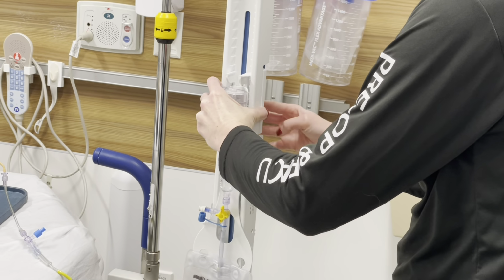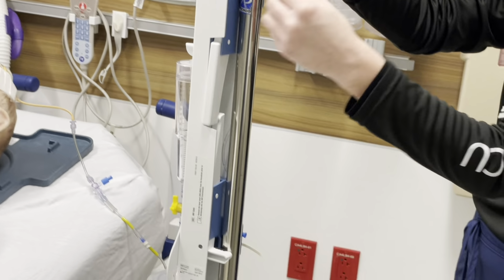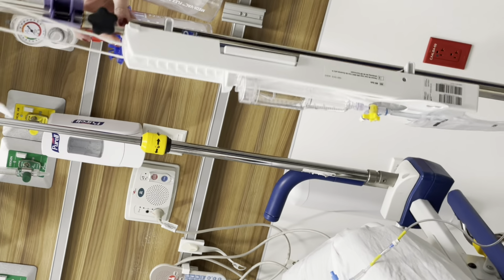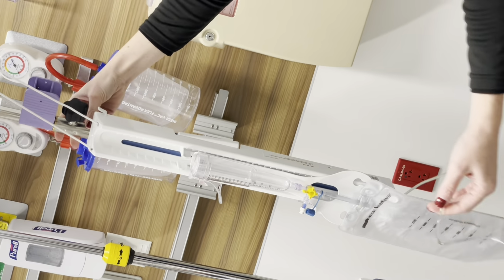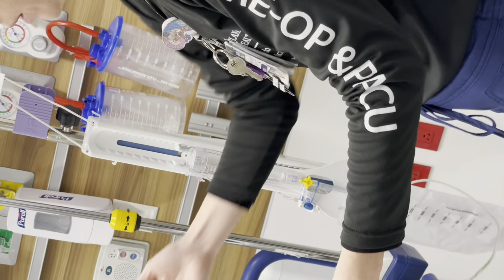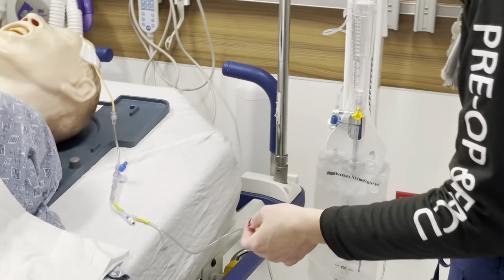It also comes with these little safety straps on the back where they will go and attach this way and attach this way. Okay, normally they have a little piece on here. They will hold snug, so you have two devices to make sure that it's not just going to fall off the pole. And you want to make sure that you're not twisted all around and that you're sitting on top of all your other wires, because again, you don't want anything to fall on this and pull it from his head.